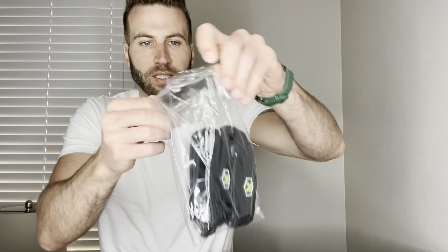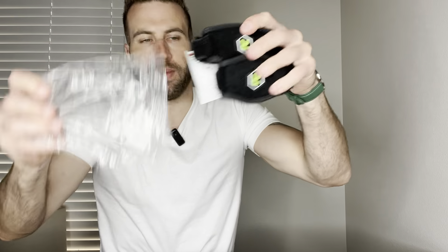That's everything in there — empty box. And here is what we get. It comes in this nice little bag. Let's go ahead and take it out of the bag. Got this little manual right here, and then we've got the elbow braces.